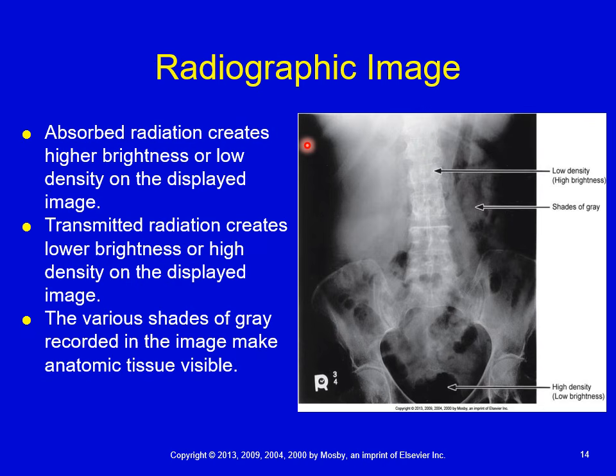All right, if more of the X-rays pass through the body and reach the image receptor, meaning more being transmitted, in those areas on the X-ray image, they will be darker.